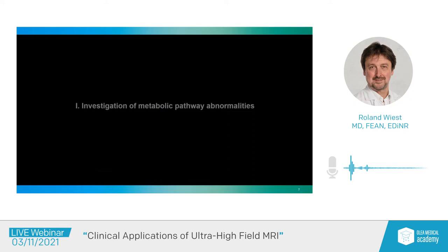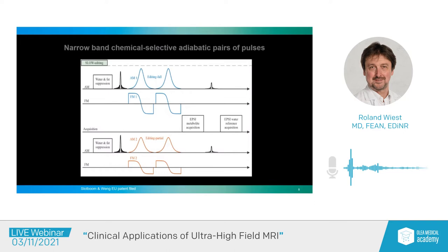I would like to go through 4 major challenges. The first one is the investigation of metabolic pathway abnormalities. And here, I think one of the definite advantages is the application of echoplanar spectral imaging.